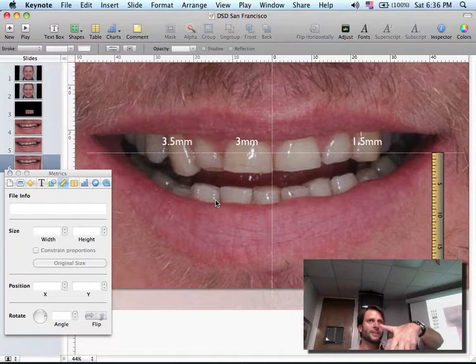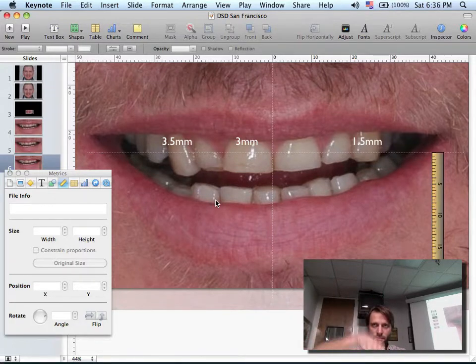Then the third step is the lingual of the uppers. And when I do the lingual of the uppers, since I have the buccal of the lowers, I'm determining the VDO, the vertical dimension of occlusion. Okay, so that's the third step. To make this decision on the wax up, I have to then play with the incisal pin, and I will look at how much length I'm adding on the uppers to see what I need to do with the vertical to keep a nice path of protrusion.